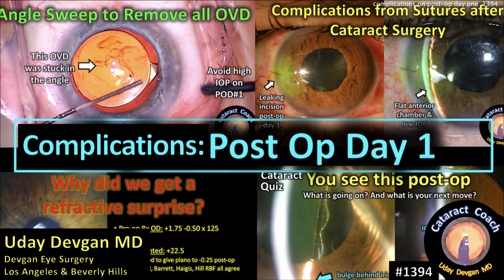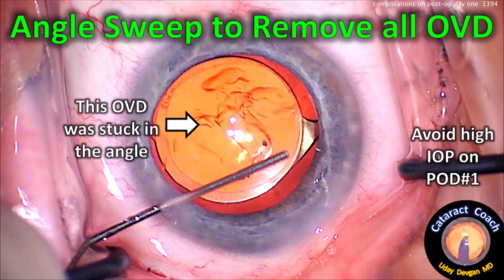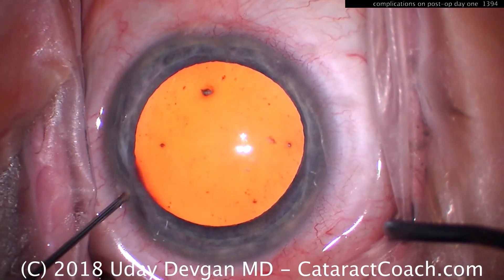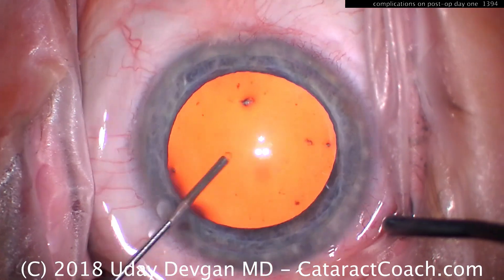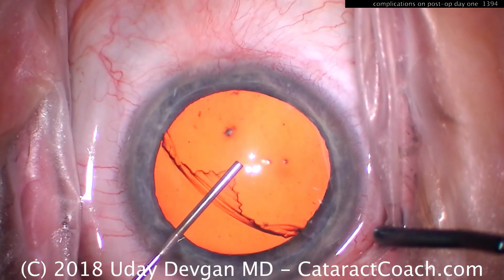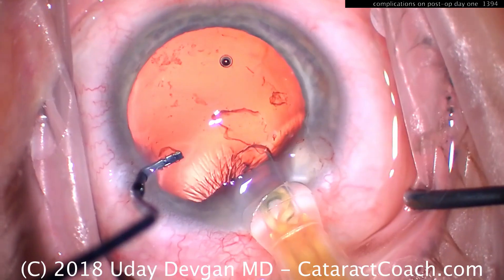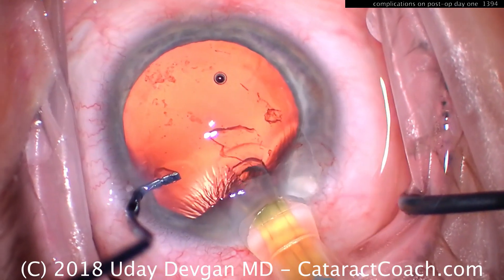From cataractcoach.com: complications on post-op day one. These are two common things you may encounter and you have to be able to recognize. The first one is retained viscoelastic. Look at this case — a routine case at the beginning of surgery, putting in the viscoelastic. Notice how that dispersive viscoelastic is pushed into the opposite angle with the most force.